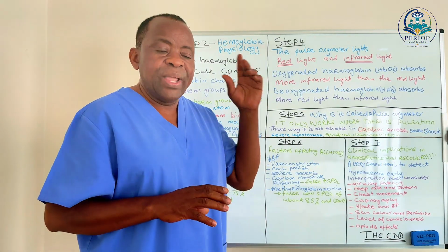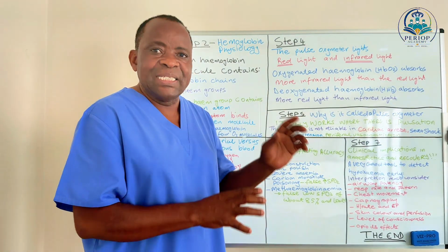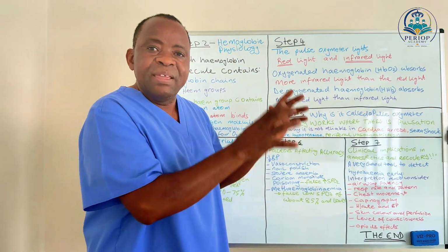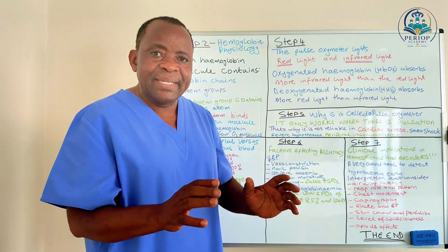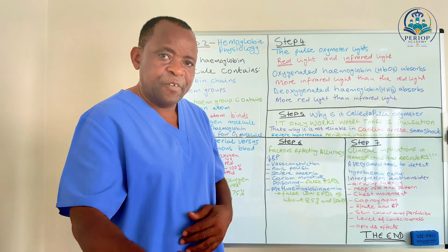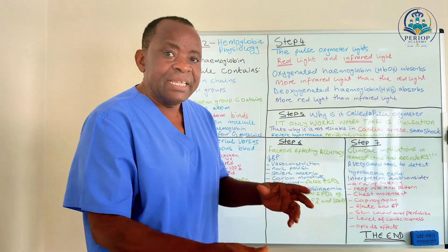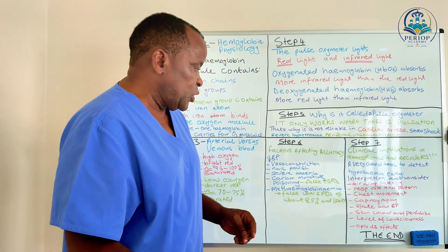And by the way, we are not nursing the gadget, we are nursing the patient. The gadget is there just to give us a brief overview, but our eyes are focused on patient safety, aided by the gadget which we have.